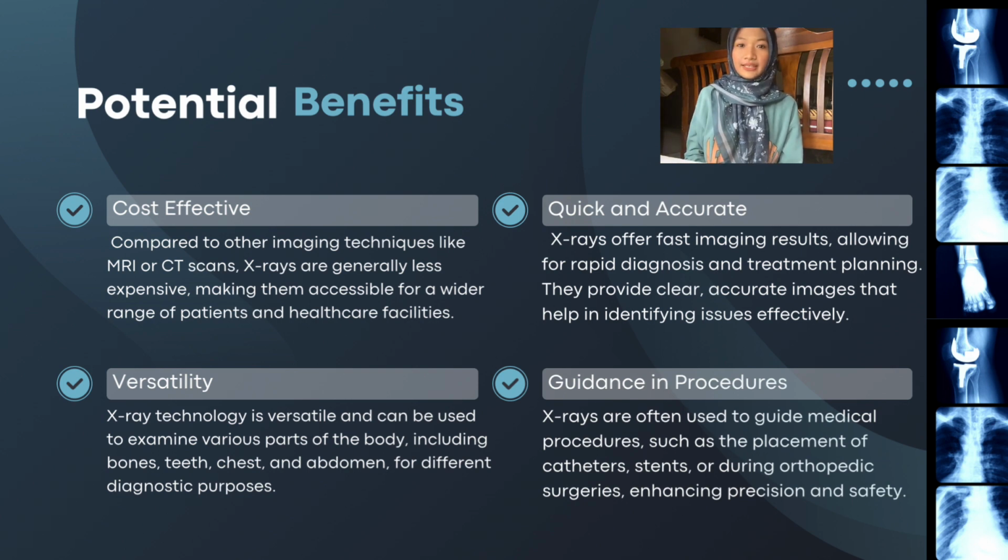Thirdly, versatility. X-ray machines are incredibly versatile diagnostic tools that find applications across a wide array of medical specialties. From radiology departments to orthopedic clinics, dental offices, and emergency rooms, these machines play a pivotal role in healthcare delivery. They are capable of producing detailed images of bones, joints, soft tissues, and organs, allowing healthcare providers to diagnose and monitor various medical conditions and injuries with precision.